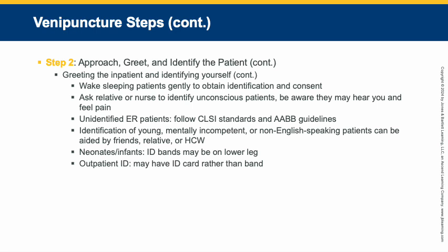We don't know the name yet, but at least it gives you numbers to match up with your requisition, because that patient, when they come in, they're still going to be assigned a temporary ID number. Okay, so once they find out who the patient is, then they can change that up and add the patient's name and so on. But this temporary label number should match up to your labels that you have. And then when they get a permanent number, you can cross-reference it with the temporary number and still make sure that all of those results go across as the same patient. Okay, so that one's a little more complicated.